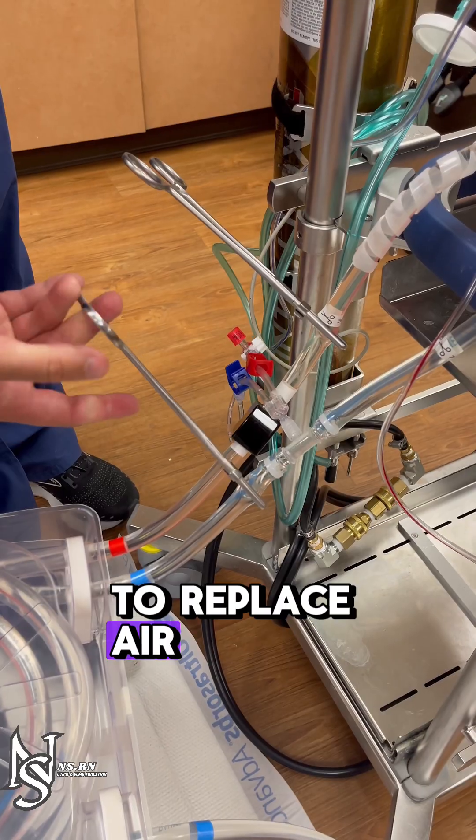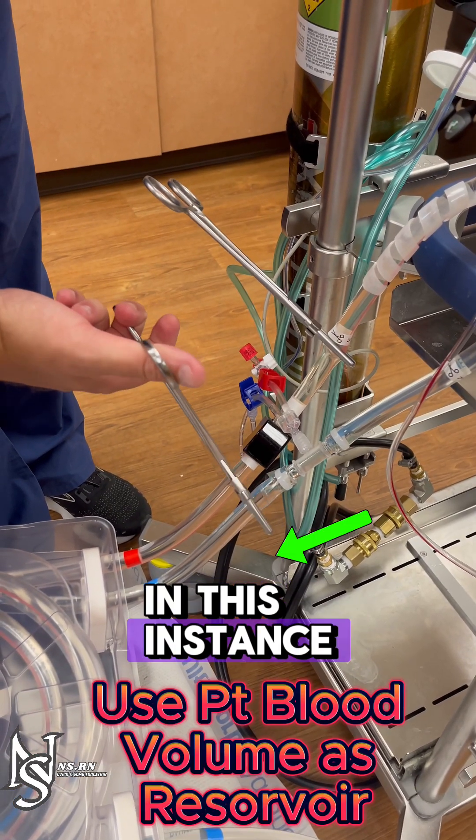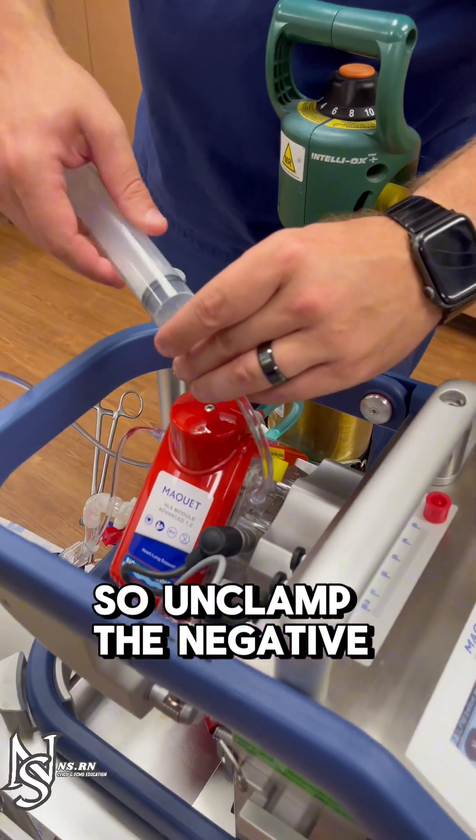Remove the yellow cap. To replace air, you need some source of volume. In this instance, we do not have fluid readily available, so unclamp the negative side.